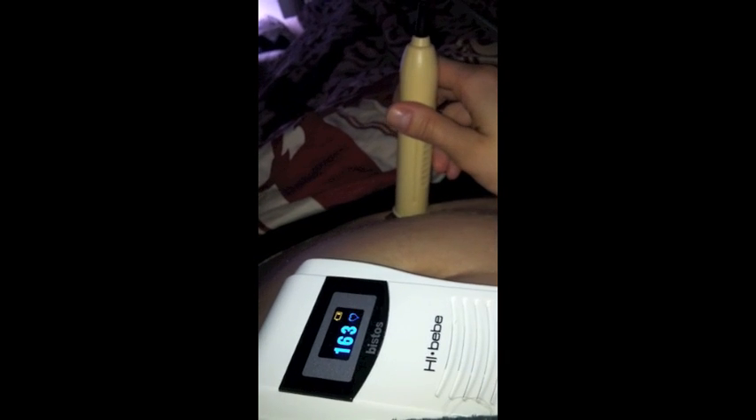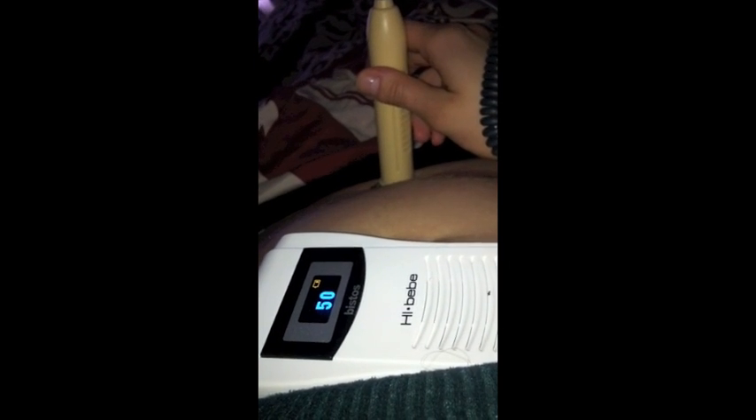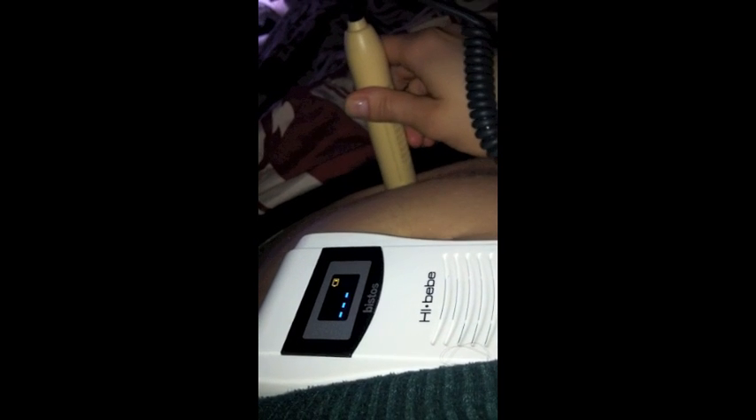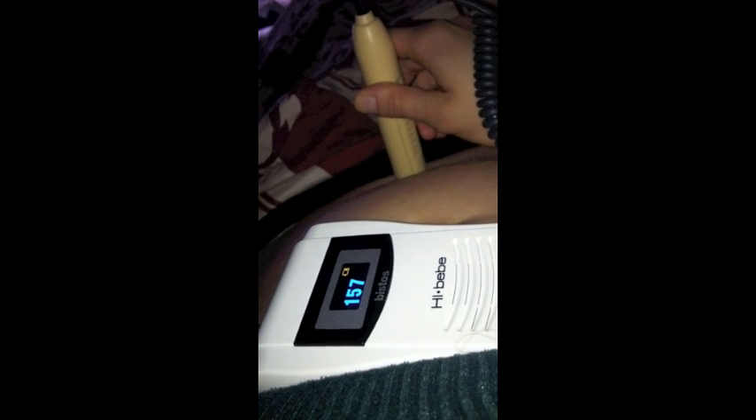Although I sort of position myself awkwardly. Let me move this a little closer. So once I do find it, I want to make sure and check what the heart rate is. There we go. Sometimes I have to play with the angle to find the highest volume. So I'm applying a little more pressure. There.